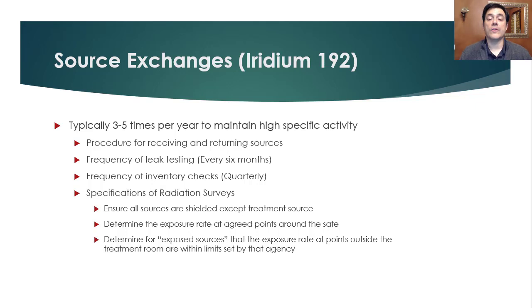For the source exchanges, you will replicate the initial commissioning survey of all of the areas adjacent to the vault to make sure that that singular exposed source gives you a consistent result, maintaining the levels to the general public as low as reasonably achievable.